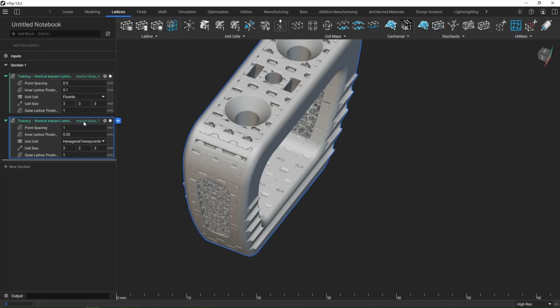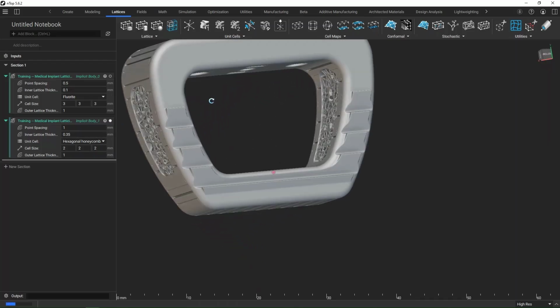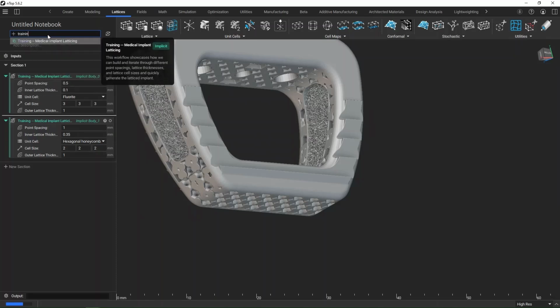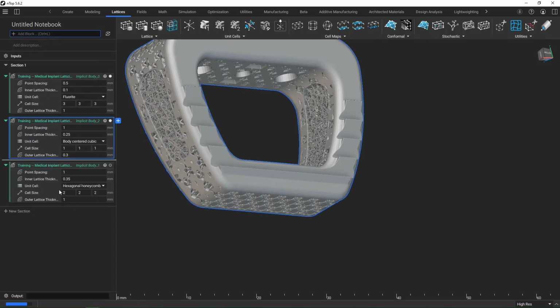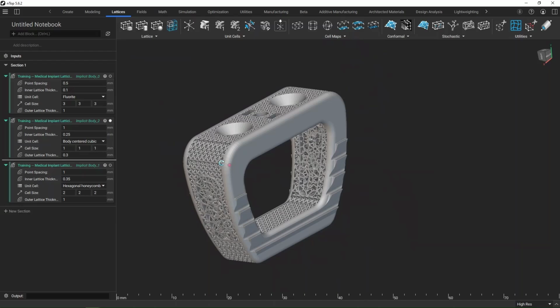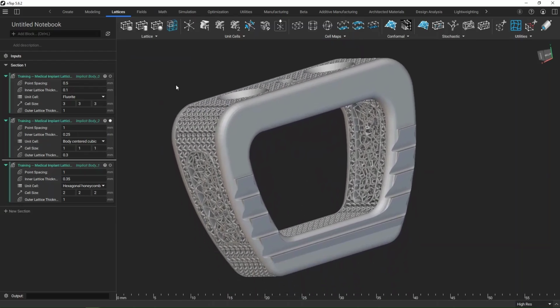Here we've got them sitting right on top of each other. But what we can do is very quickly see different examples. Maybe I want to add another one in there too. Probably should have renamed this so it doesn't have that training right on there, but as you can see, we've got those different inputs, different things that we can play around with, have full control, but also be able to hide away some of the other aspects that maybe don't need to be played around with. So as you can see, quick example for how we can make our workflows reusable.